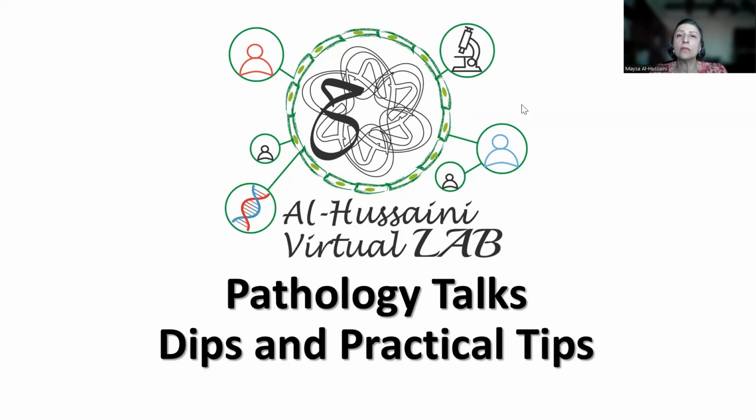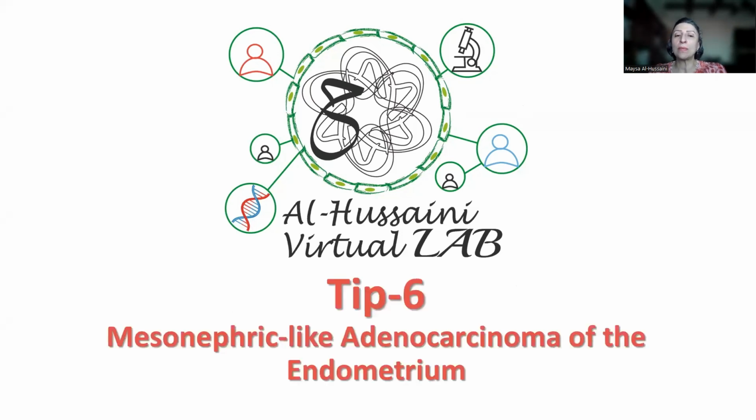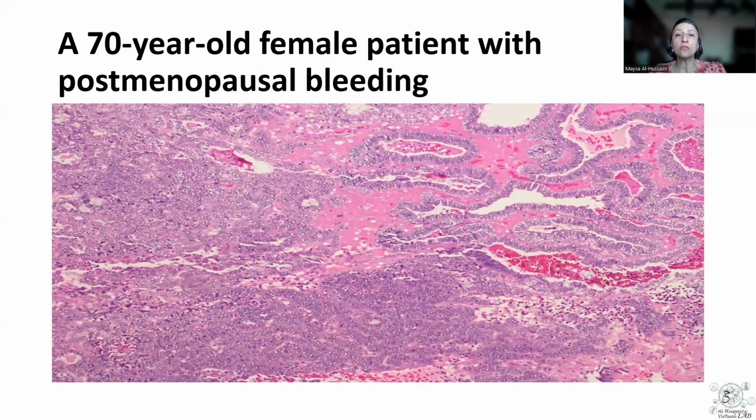Today, we're going to share another important tip that you might encounter while reporting endometrial tumors, which is the newly described entity Mesonephric-like Adenocarcinoma of the endometrium. So this is actually a case of a 70-year-old female patient with postmenopausal bleeding. And this is a low-power magnification of an endometrial adenocarcinoma.